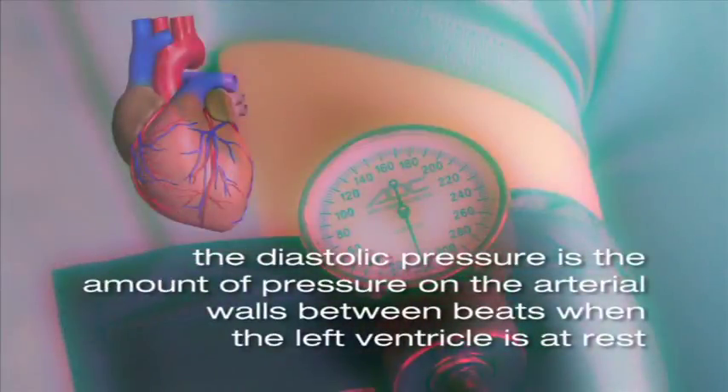The diastolic pressure is the amount of pressure on the arterial walls between beats when the left ventricle is at rest. You arrive at this reading when you can no longer hear a heartbeat through the stethoscope.